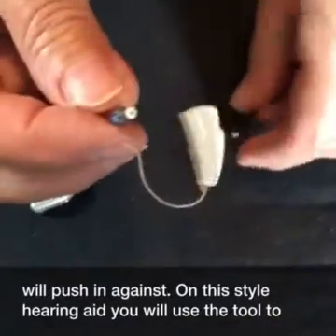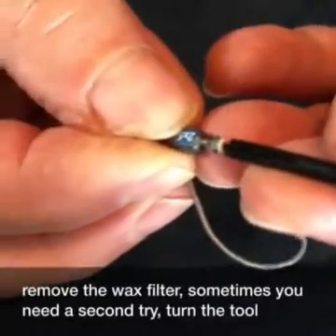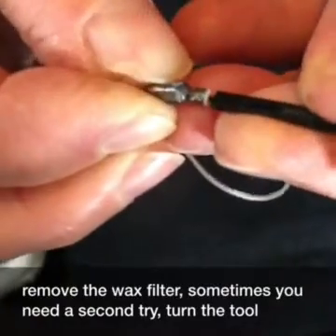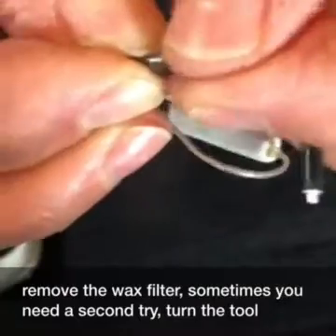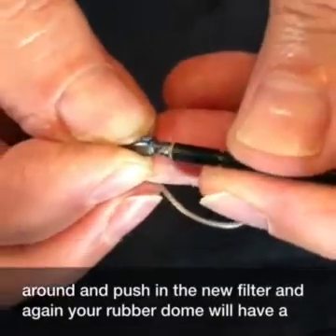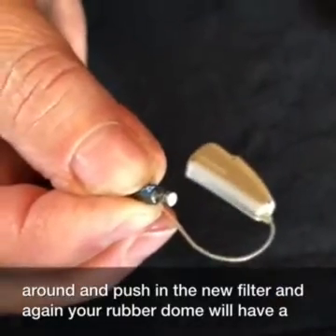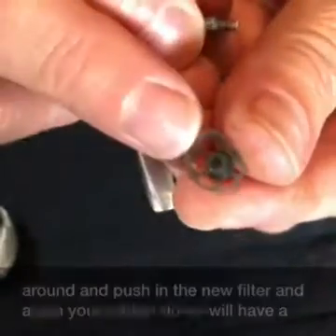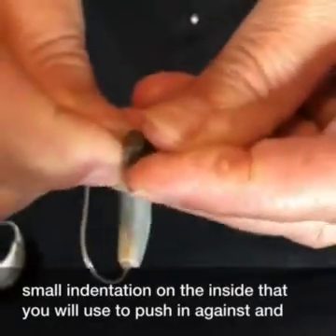On this style hearing aid, you will use the tool to remove the wax filter. Sometimes you need a second try. Turn the tool around and push in the new filter. Your rubber dome will have a small indentation on the inside that you will use to push in against.